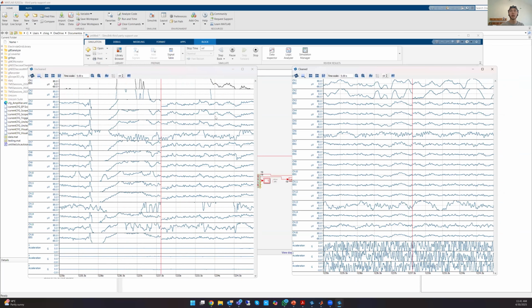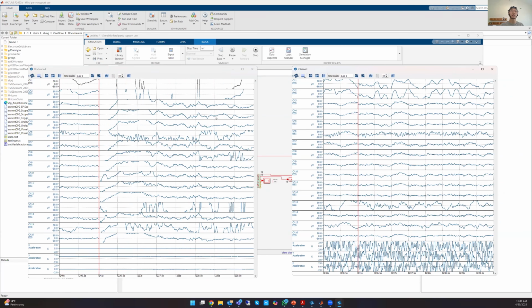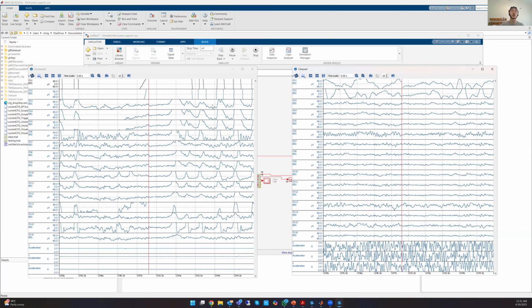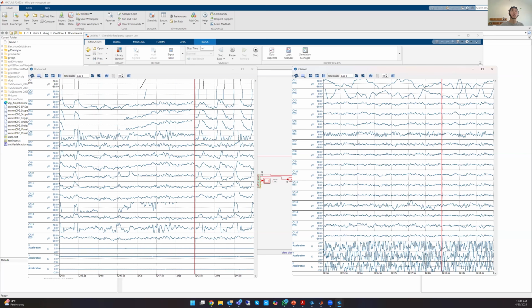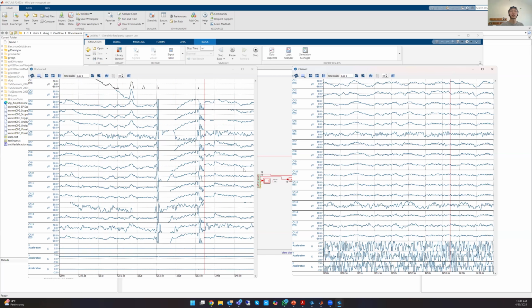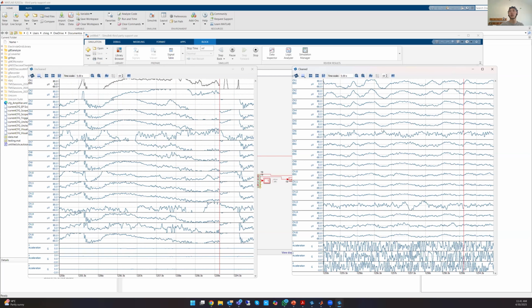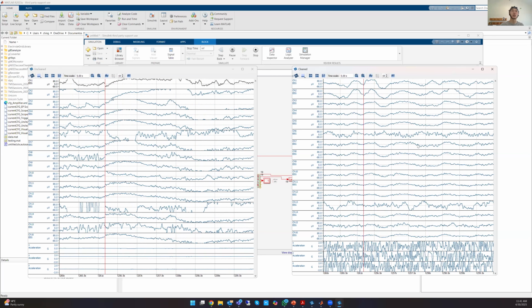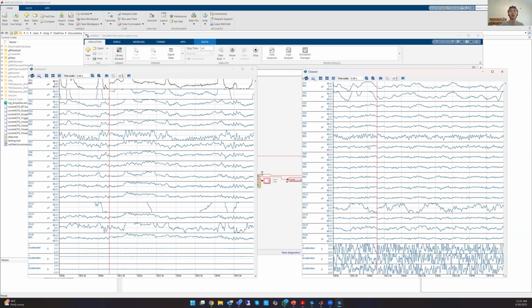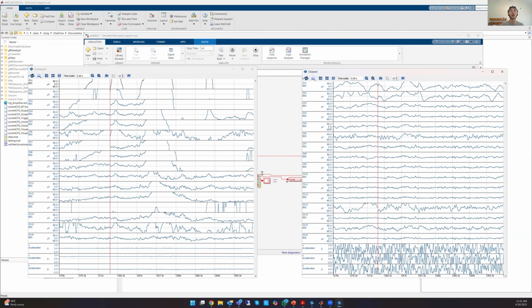Let me do the test again, then you can compare the data. So eye blinking, you see a huge artifact here. The OSCAR filter removes it. Clenching of teeth: huge artifact again, EMG signals, but through OSCAR it is gone. So even with dry electrodes, after OSCAR, the data is pretty easy to see, which makes the experiment really fast.